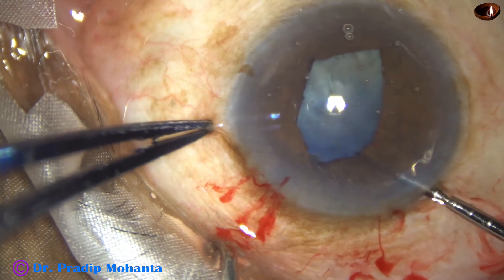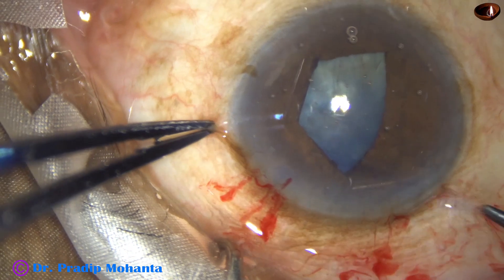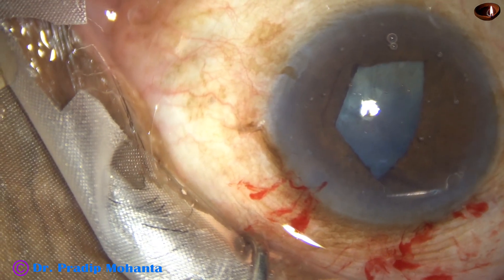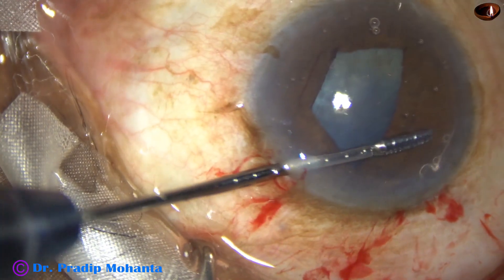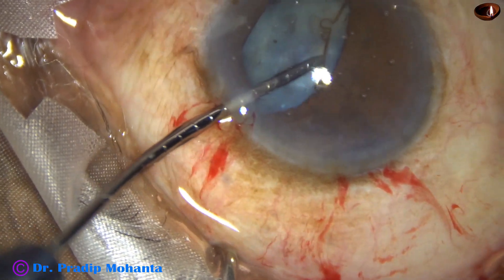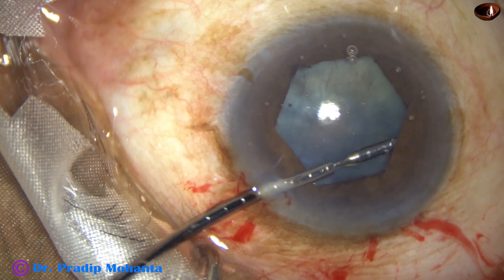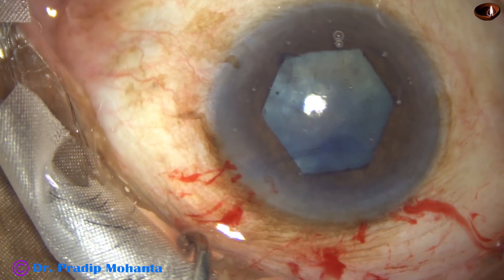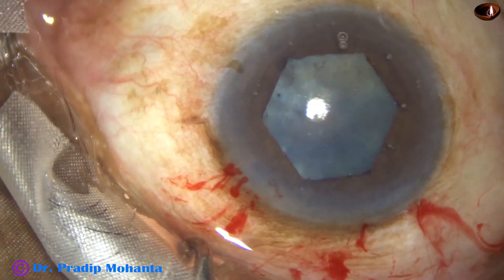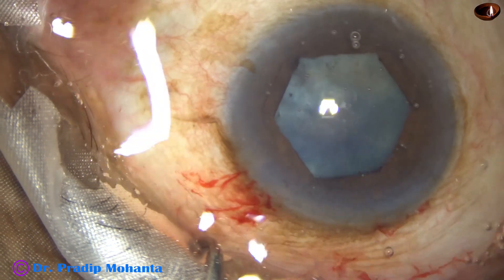In this case, one corner is not tucked properly, so go again and tuck it properly. With the help of the left hand, we hold this flange, hold this tab and tuck the flange which is towards 10 o'clock. We have only one side port, and with the help of only one side port, we have managed to put this iris expansion device.